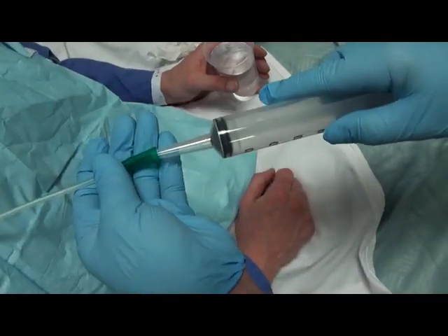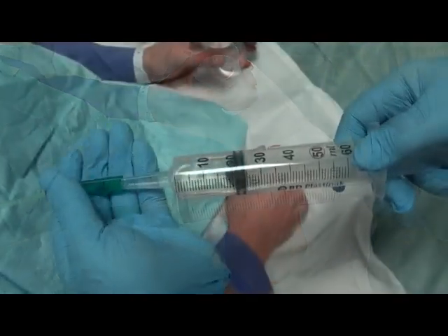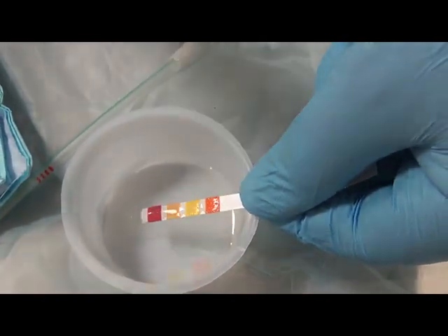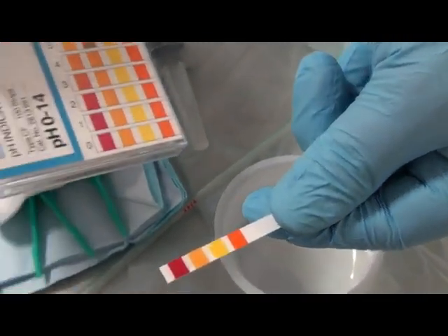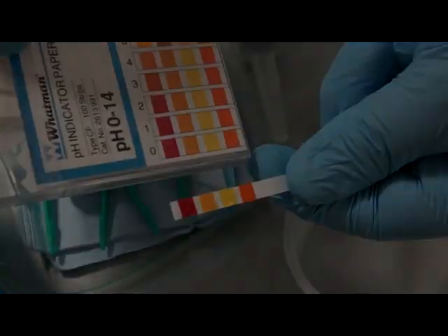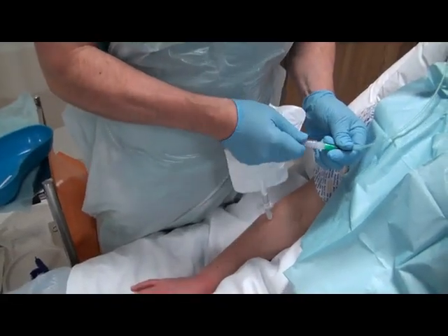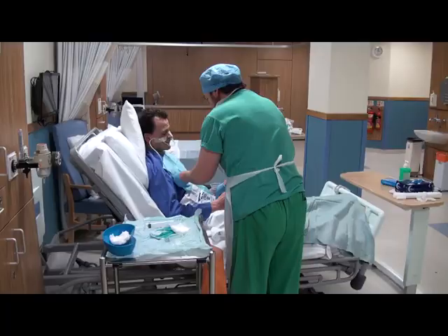Confirm tube placement by aspirating from the tube with a large volume syringe and test the aspirate with pH indicator strips to confirm tube position. Next, connect the tube to the drainage bag to allow drainage of any gastric contents.